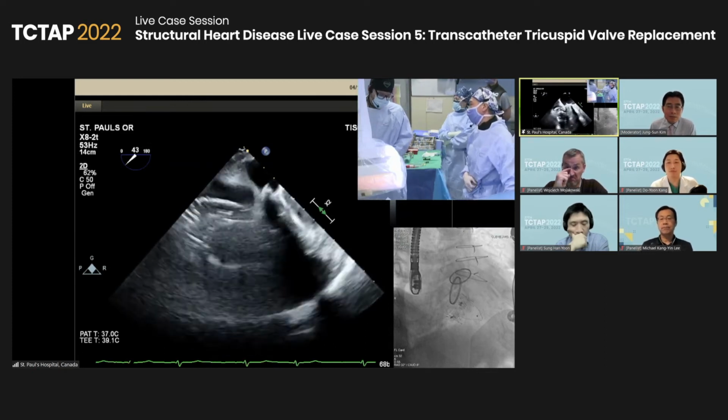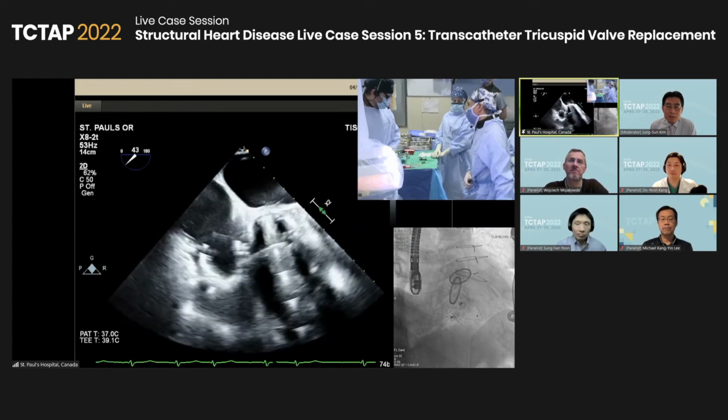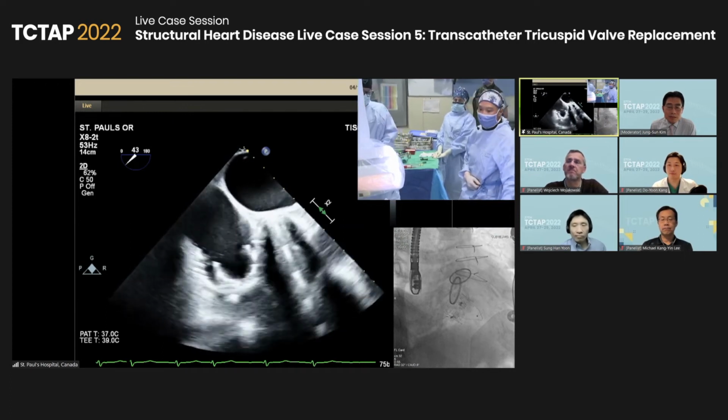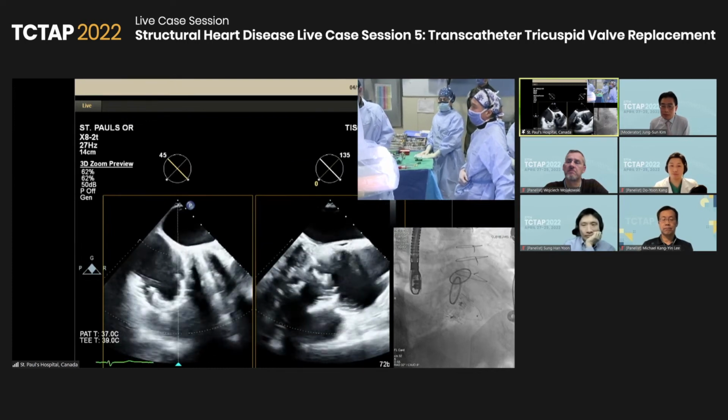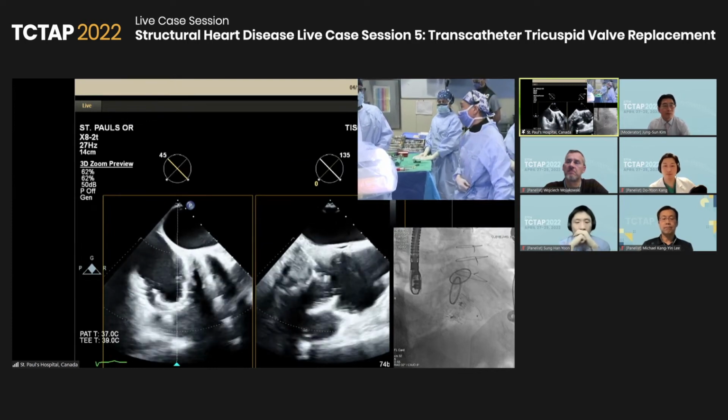Yes, with quick renal function improvement. The majority of our patients have a GFR less than 25, and they actually have improvement of that. So far, the short-term results are encouraging.